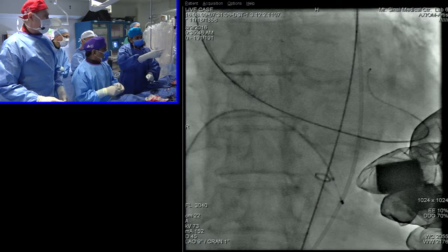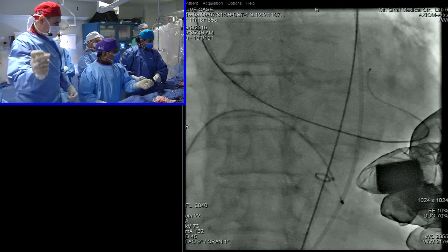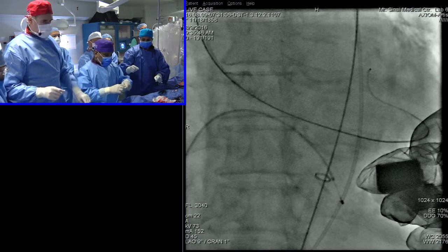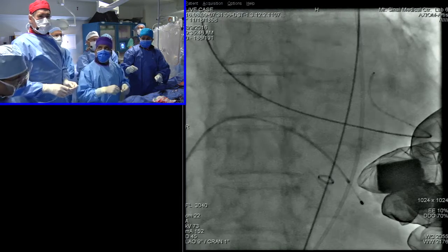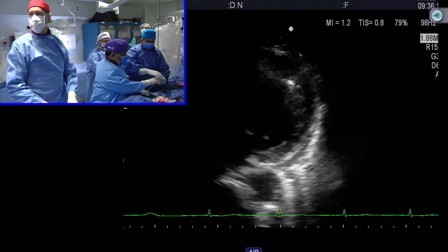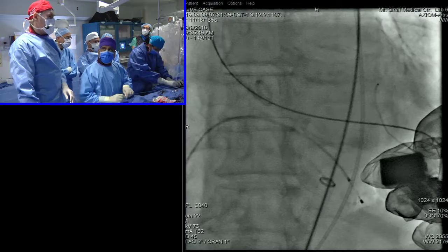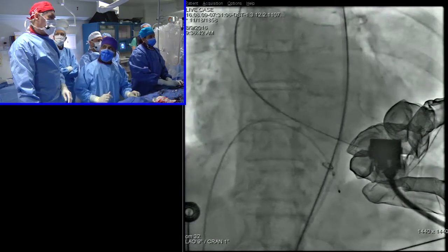Or you're okay? Yeah, we are okay. The wire is okay? The only thing is that the tip of the wire is not free. It's kind of a little entangled. So I think you might want to just clear it off. You can show the echo, and it will be very useful to notice this point. Just if they are showing the fluoroscopy, if you see there, the tip of the wire, what Partho is saying, that is not free, you can also see there. So you've got to have the tip of the wire free. So show both pictures, picture in picture, with the echo and the fluoro.